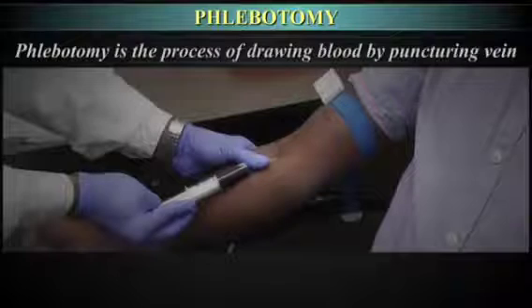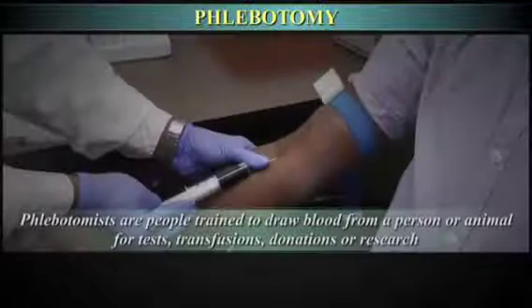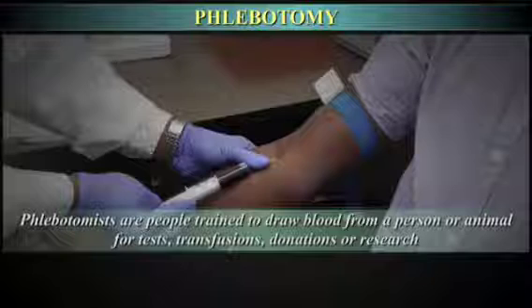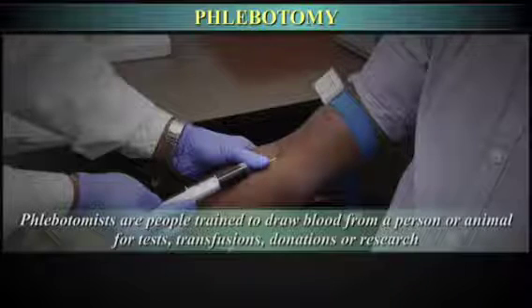Phlebotomy is the process of drawing blood by puncturing the vein, and phlebotomists are people trained to draw blood from a person or animal for tests, transfusions, donations, or research.